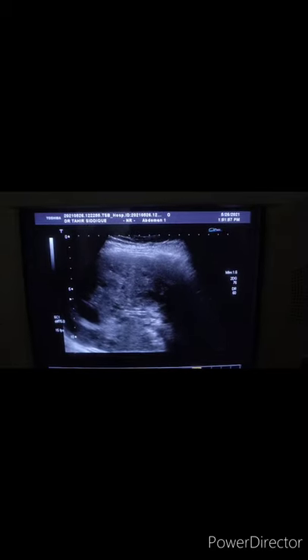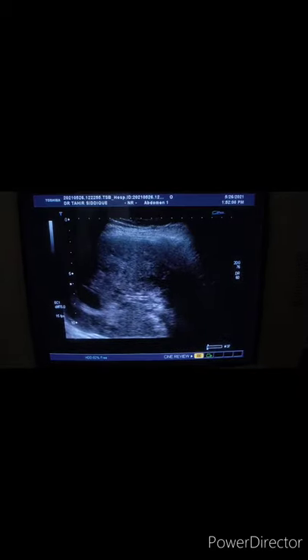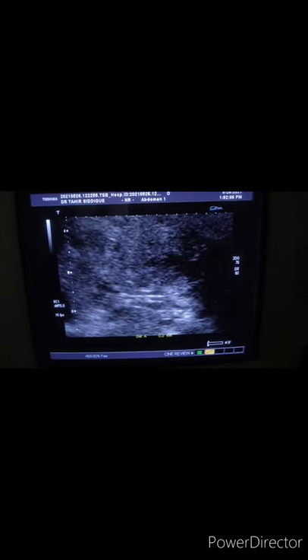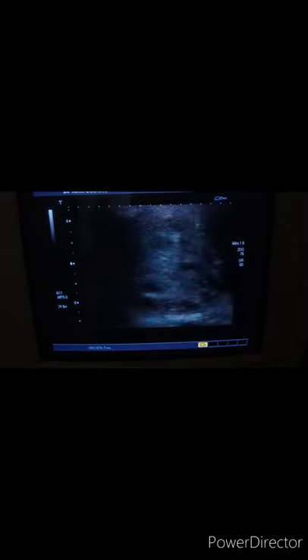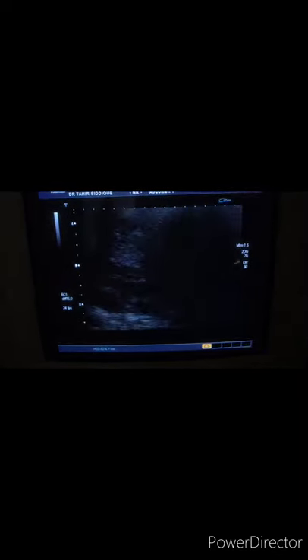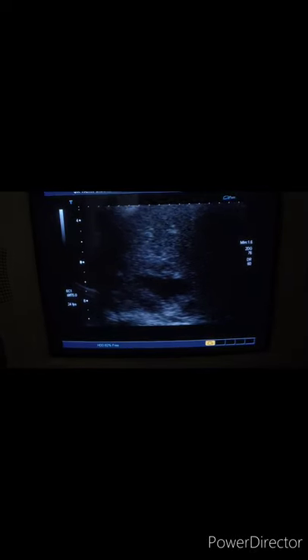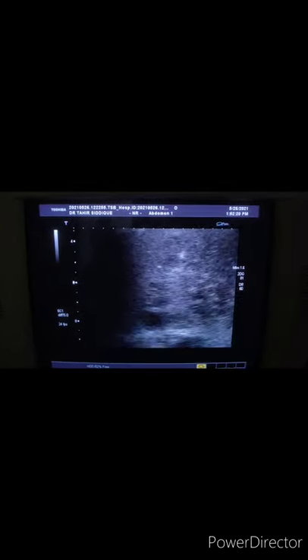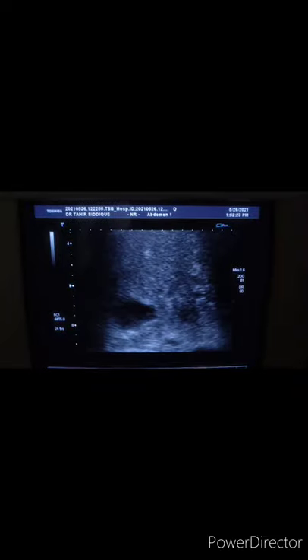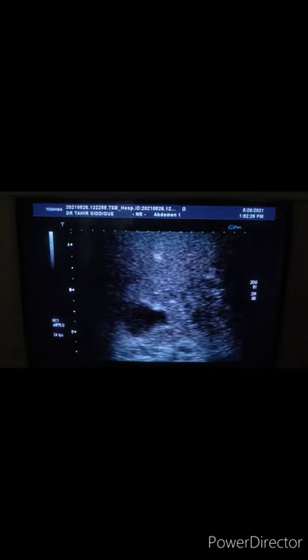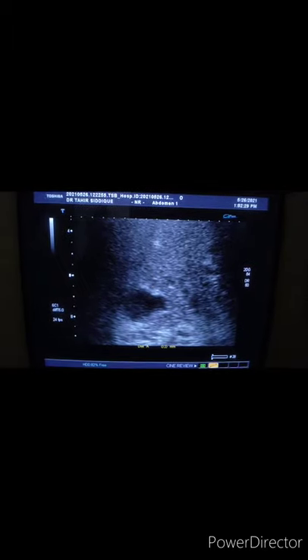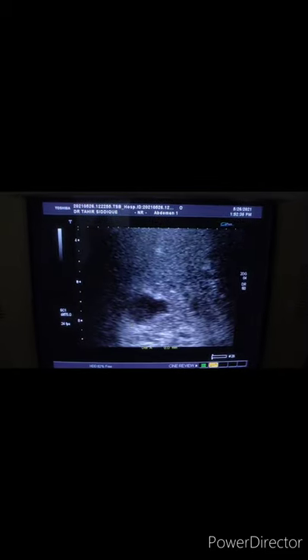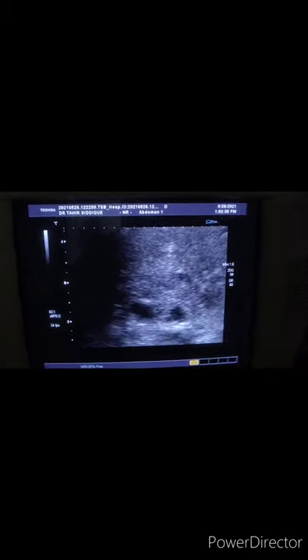Here you can see the common bile duct with the stent within it, and these are the cystic areas coalesced together that were being discussed. This is in the posterior segment. Moving the probe to check if the cysts change shape — you can see there are echoes within them. Taking one of these cysts: it is irregularly outlined, with thick borders and internal echoes.